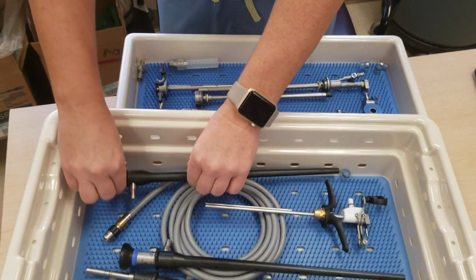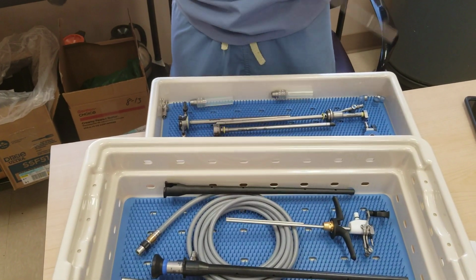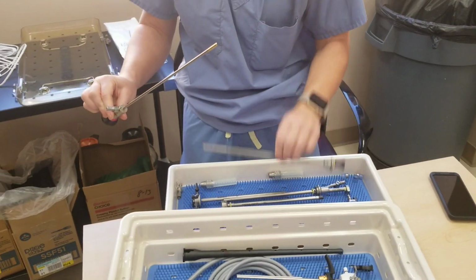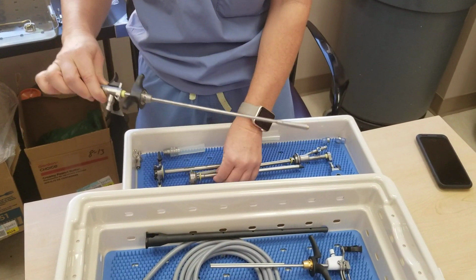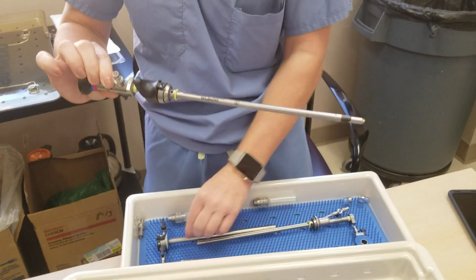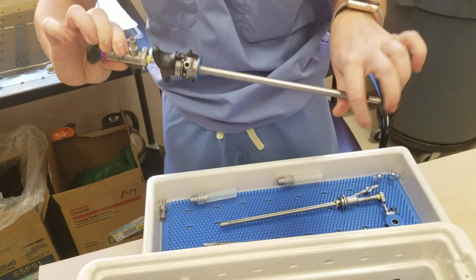So the way that it connects, you'll take your lens out of the protective tube. If they want the visual obturator, it's this guy. If they want the blind, it's just this. We'll assume they want visual, since most do. This just snaps in, and then this will snap in to your inner sheath. This will snap into your outer sheath, and then you're ready to go into the patient.